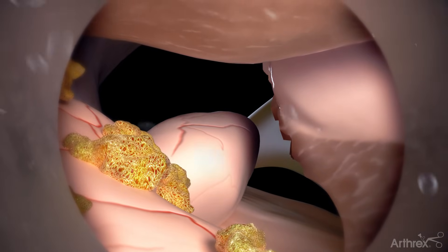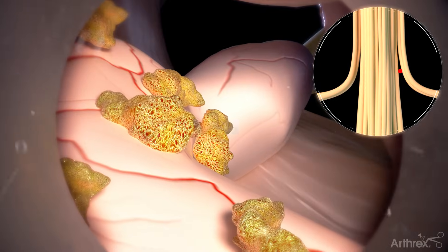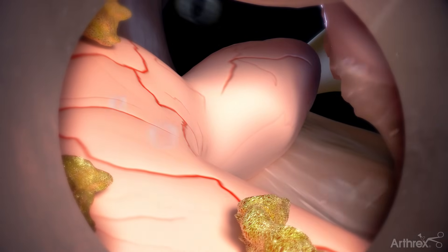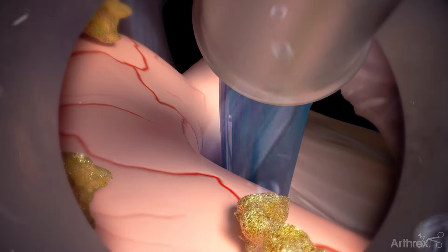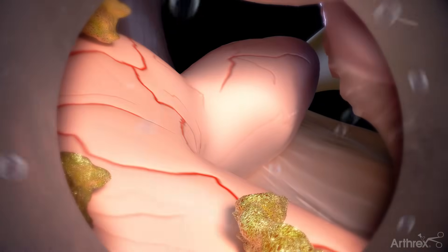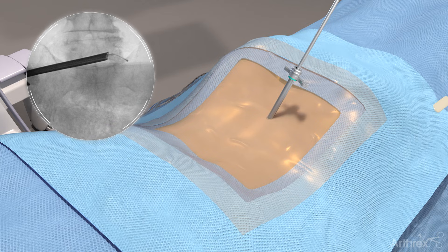Identify the exiting nerve root by following the medial border of the dura until you reach the nerve root's axilla. Remove excess fat tissue with the electrosurgery probe and forceps. Then display and assess the nerve root. Use the electrosurgery probe or a ball tip probe along with direct visualization to ensure the effective decompression of the contralateral foramen.